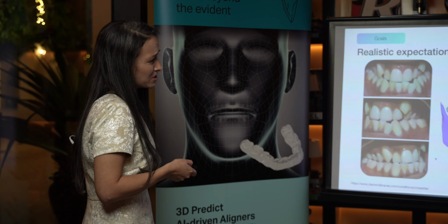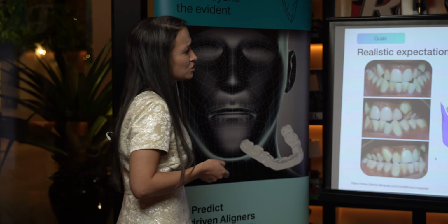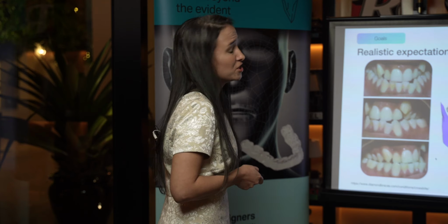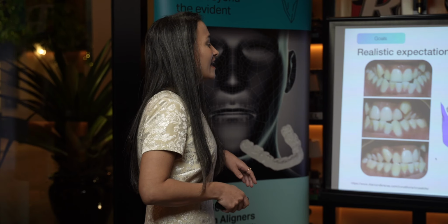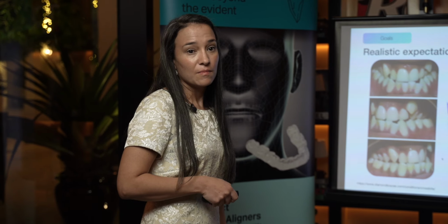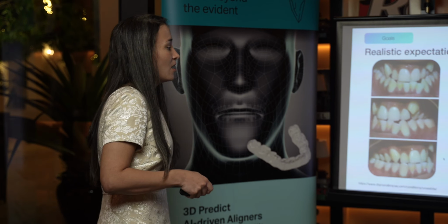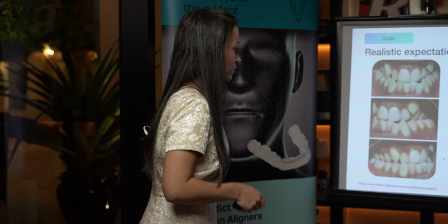And you see here, there might be some gingival recession on the canine, but nothing too bad. You still see the tissue blanching, not as bad as I showed you before. But when they raised the flap, they actually noticed there was a lot of dehiscence on this patient, because this is a product of extreme expansion, extreme proclination of those teeth.